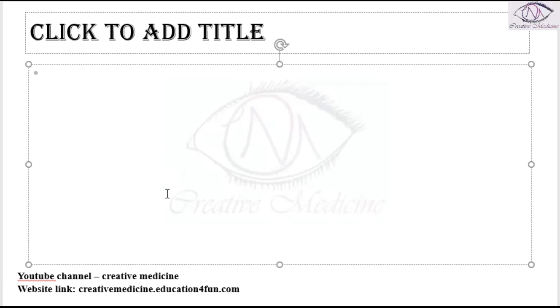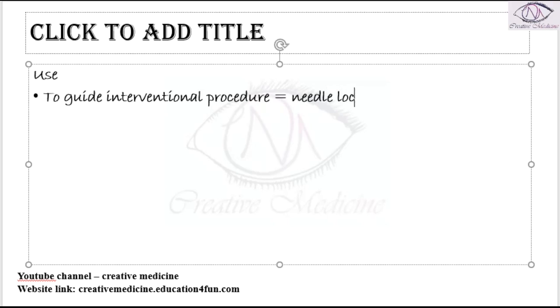Then the uses of mammography: it is used to guide interventional procedures. Interventional procedures can be done with the help of mammography, like needle localization, and needle biopsy is also done with the help of mammography.